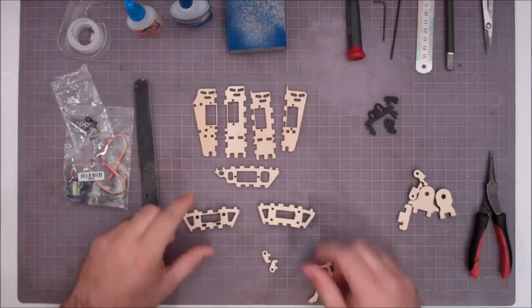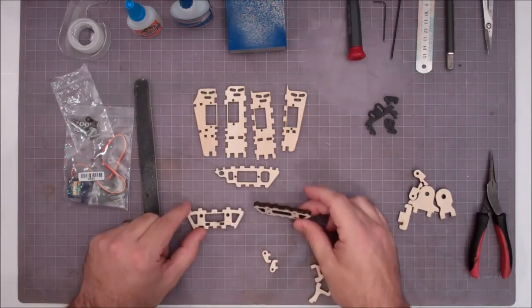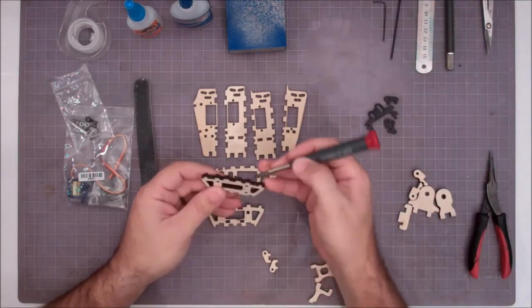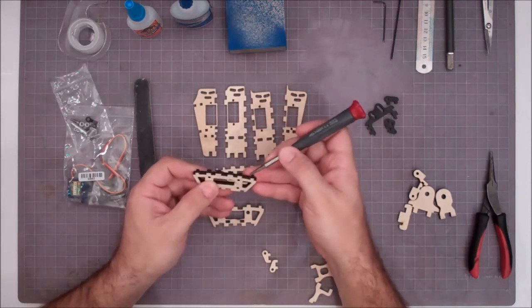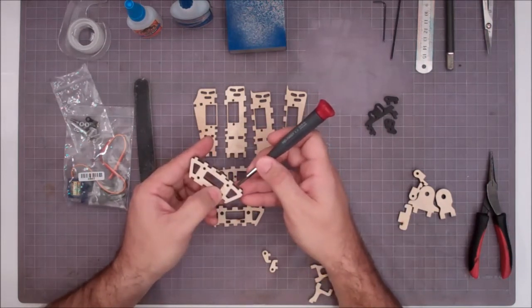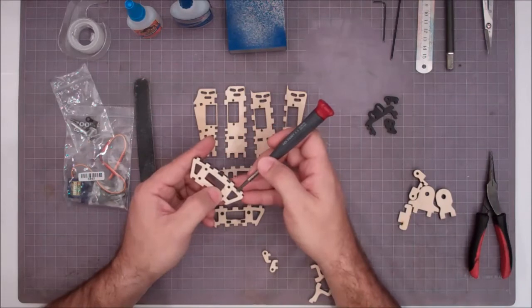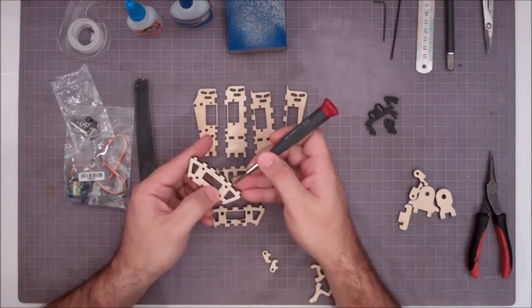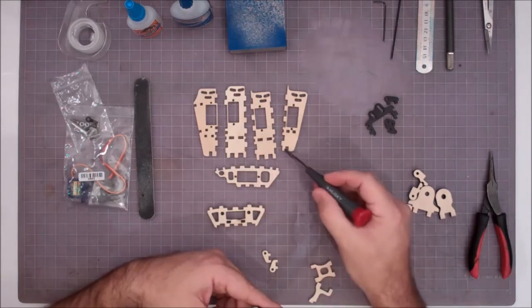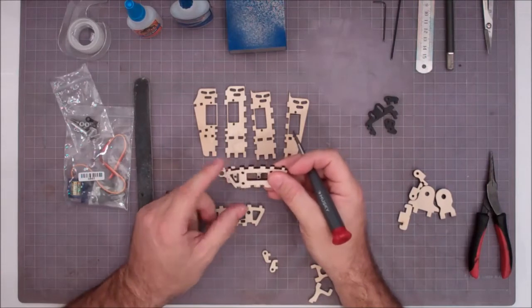Now we need to look at these 2 plates. These are kind of hard to determine which side is where. The best thing that I've found is, find something to point with here. There are these first lugs sticking up on each side. And if you look at the lug and then you look at the flat next to the lug, you'll find that one of the flats is longer and one of the flats is shorter. And I have highlighted this in the exploded view diagram so you can see where I'm talking about. But little flat right here, just on the inside, it corresponds to this tab on the palm plates. And you can see this tab is wider than this tab. So, look for your wider flat next to the lug, and that becomes the thumb side of your plate.